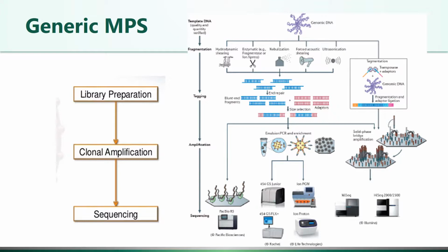And so when you have completed the sequencing phase after the clonal amplification, you can essentially build back, through bioinformatics and alignment against a reference sequence, the complex mixture of everything that you've sequenced. And as you might imagine, you can get a highly sensitive representation of all of the different fragments that are in there. So in the setting of somatic cancer, if you happen to have a variant that is present at less than 20%, you actually will be able to see it with massively parallel sequencing because the fragments containing that variant are actually individually sequenced away from the rest of the fragments.